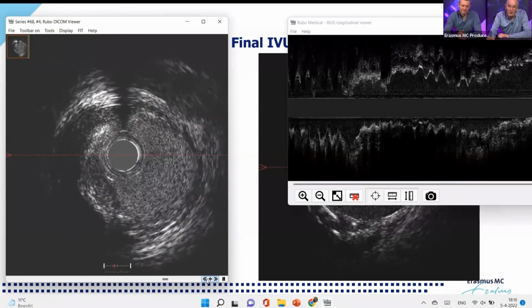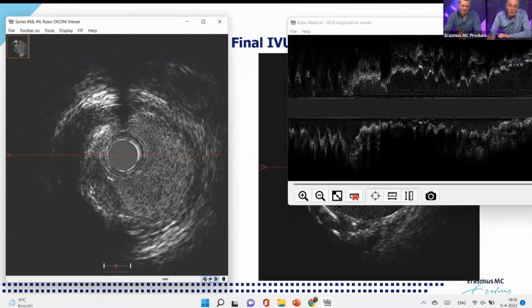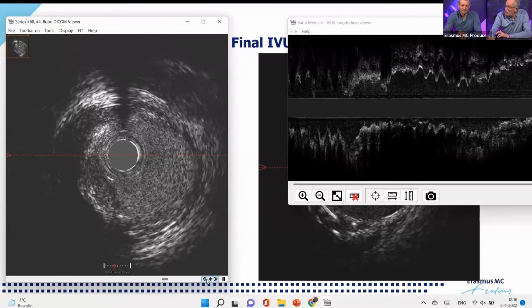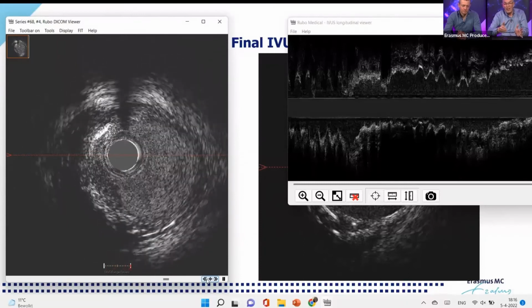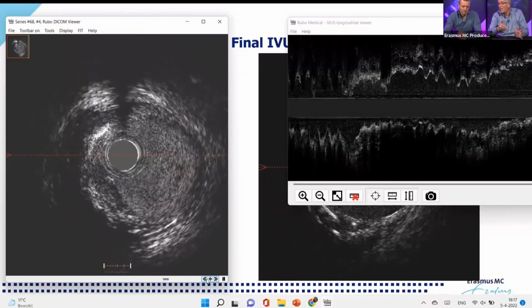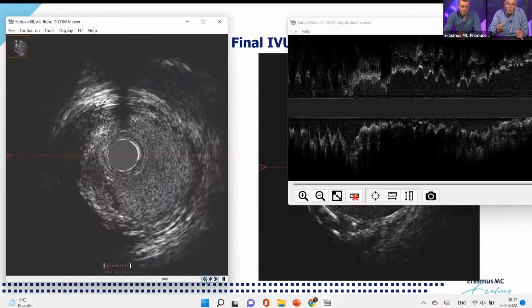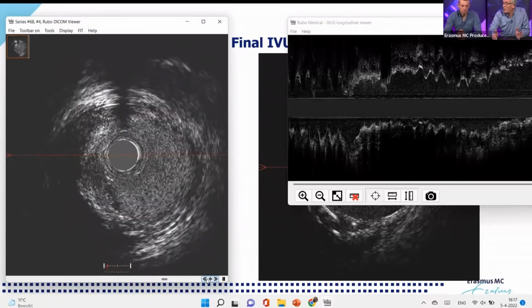And there came some really interesting things. We placed together the histology and how IVUS is working, why we see things. If you know how IVUS is working, why it's reflecting, and then you see the histology of the thrombus, you can understand why thrombus changes its appearance over time.